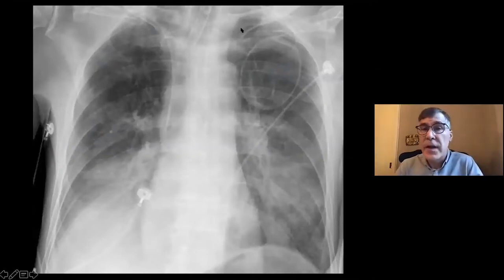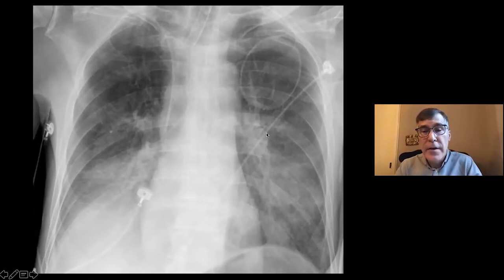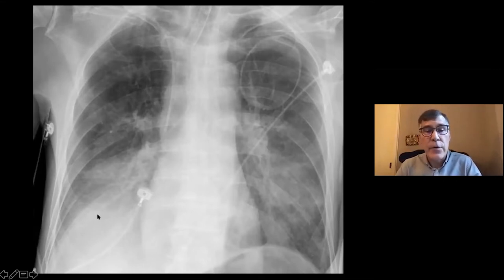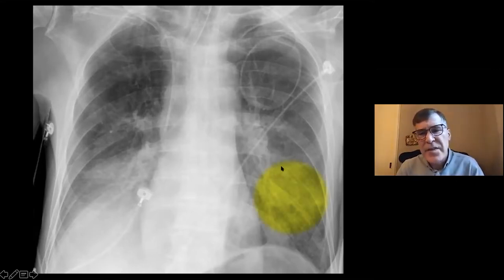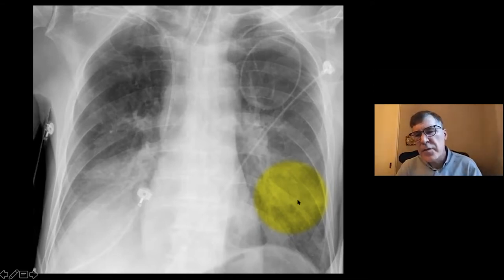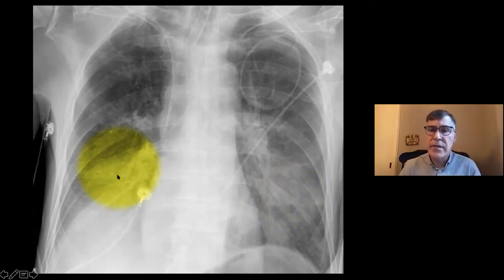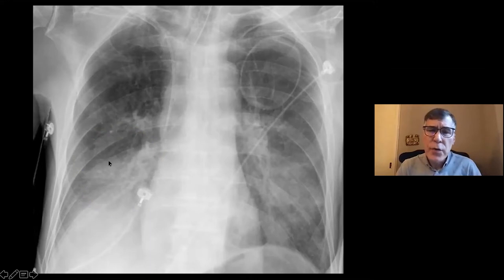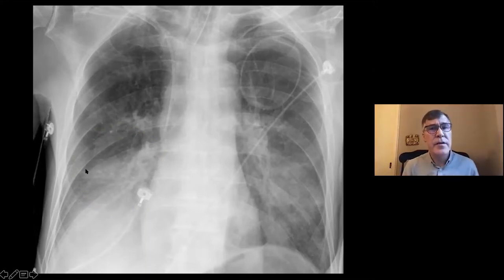This is an ICU patient with an endotracheal tube and central line. What we have here is bilateral lower lobe areas of ill-defined opacity. We see some of the vessels through ground glass, other areas we don't, consistent with consolidation. The margins are a little ill-defined and the patient does have a low-grade fever.